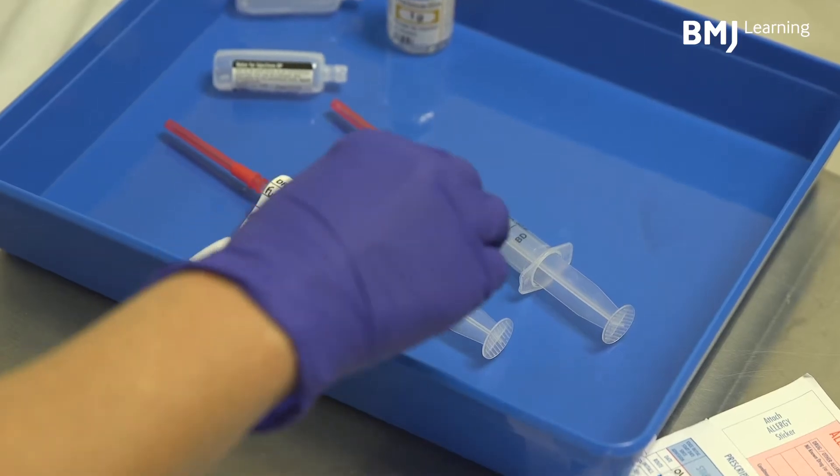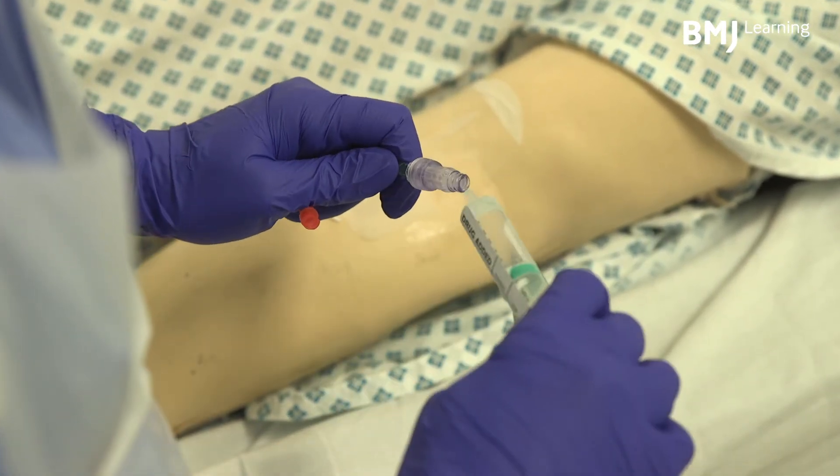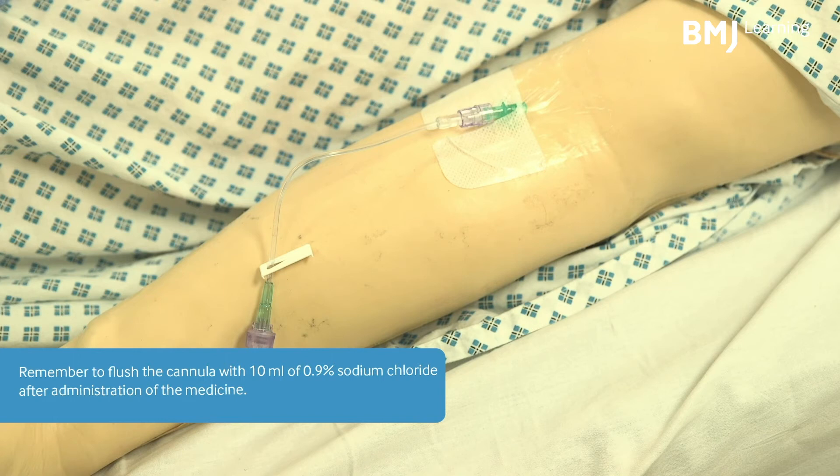Administer the medicine at the correct rate following the manufacturer's recommendations. Remember to flush the cannula with 10ml of 0.9% sodium chloride after administration of the medicine.